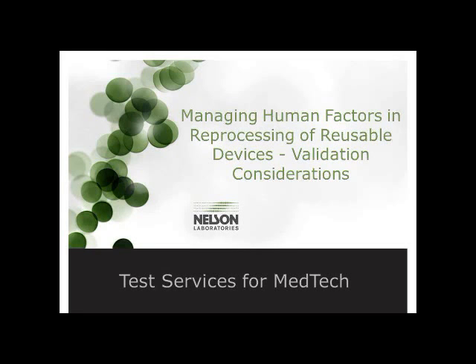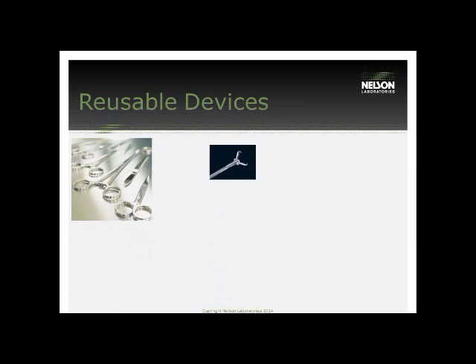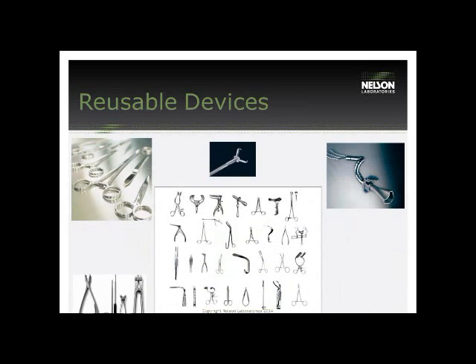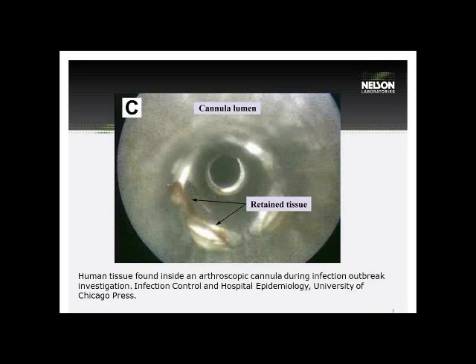Hello, and thank you for joining us for this webinar on managing human factors reprocessing of reusable devices and all of the validation considerations associated with this information. Reusable devices come in many types, sizes, shapes, and complexities. The problem with reusable devices is the cleaning, disinfection, and sterilization of these reusable devices in the healthcare facilities. There have been many issues in ensuring that these devices are cleaned, sterilized, and disinfected appropriately.